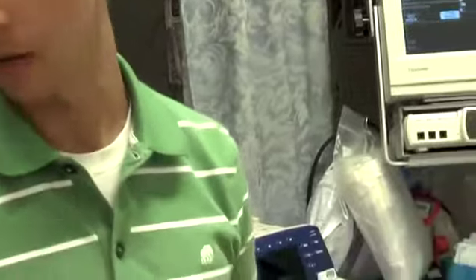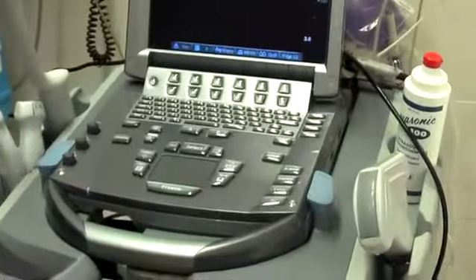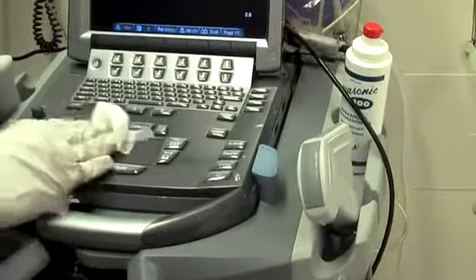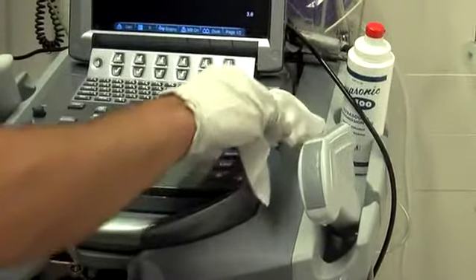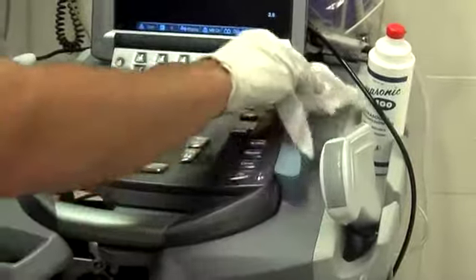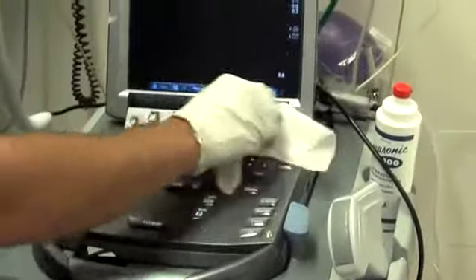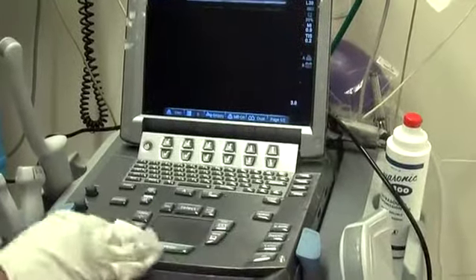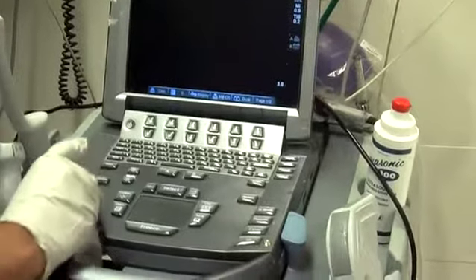The keyboard's a sealed unit. You can just give the whole thing a good wipe down before and after each use. You should avoid using these on the screen, however, because it leaves a little bit of a residue. Best way to clean the screen is with just using a paper towel above the sink, a little bit of water, wipe it off, and you're good to go.